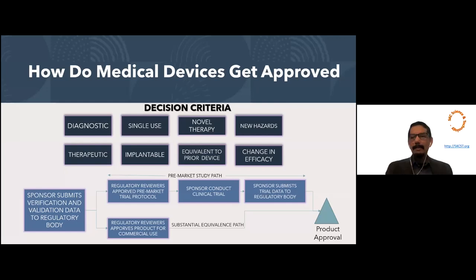So let me read a couple of questions, and at least one person wanted to ask you through audio. Let me read the question. One of the questions was that if it is a pacemaker for an athlete versus a sedentary lifestyle, they are different. How can you choose which one will be better? Is there something you take into account from a design perspective, or do you have different types of devices for different lifestyles?